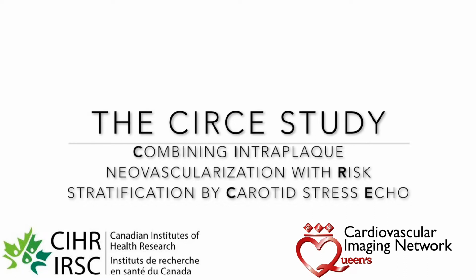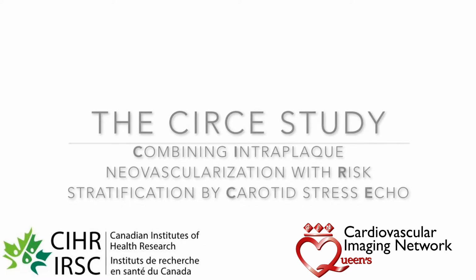As you know, CIRCE stands for Combining Intraplaque Neovascularization Risk Stratification with Carotid Stress Echocardiography. Ultrasound of the carotid arteries can be easily implemented during dobutamine and treadmill stress echoes to improve prediction of future cardiovascular events and the need for angiography.